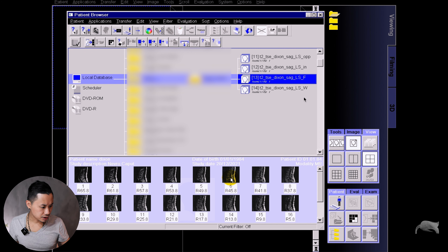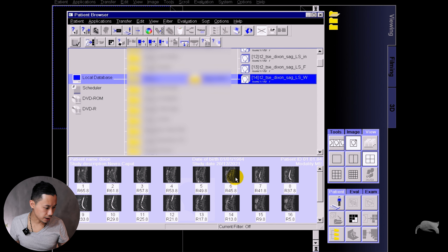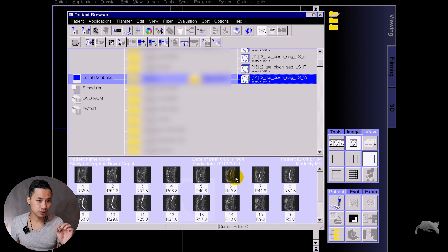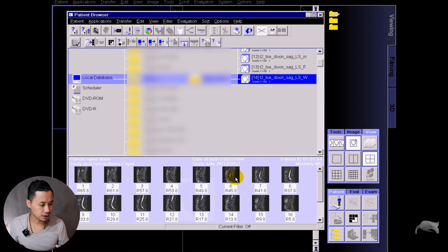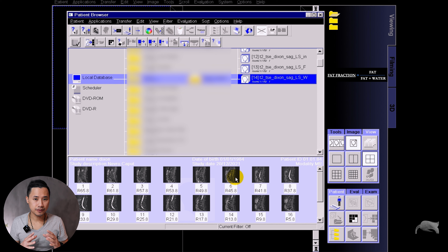In front of you now you have four sequences — it's only one scan but it's a Dixon, so you get opposite phase, in-phase, fat-only, and water-only. Before I do the quantification, I'm just going to check that the images have not been swapped or you get artifacts. I'll check the fat images — that's correct, not swapped — and water images — also correct.